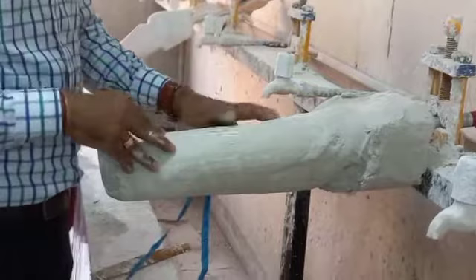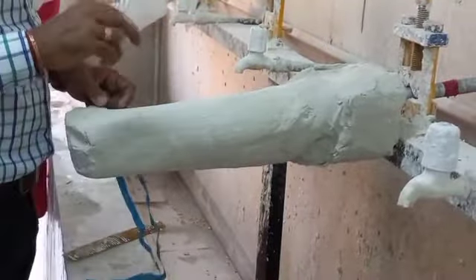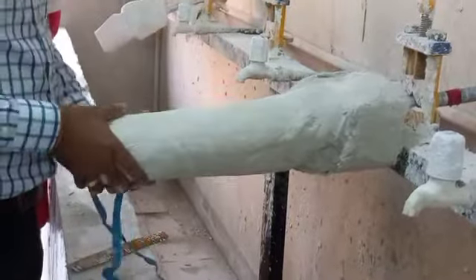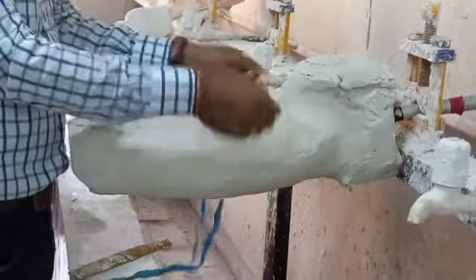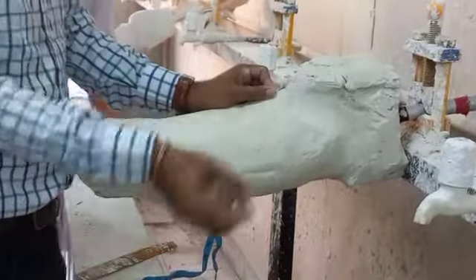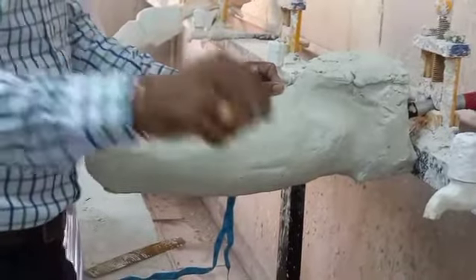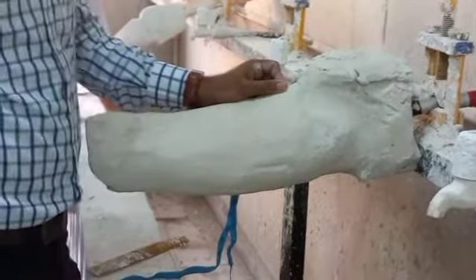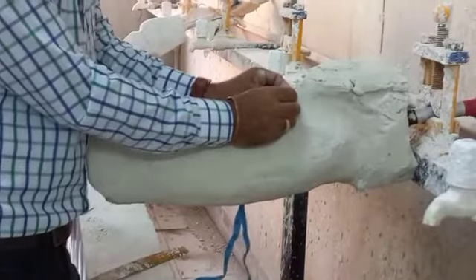That was the question. We have to take care of the precaution that the medial wall is okay, that the dents are there, that once you open it, your measurement is taken at the same position over the patient that you have taken. Just note down how much it is with respect to your already taken measurement. That means over the patient you have taken a certain measurement. At the same level, just write down the current measurement.